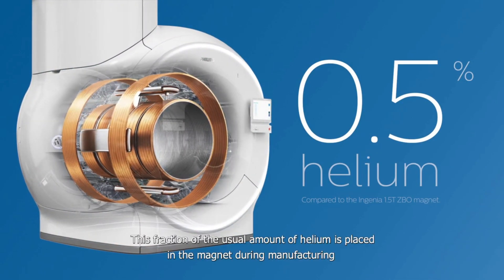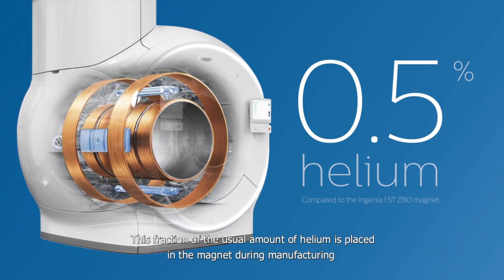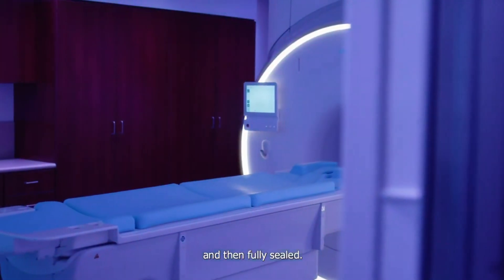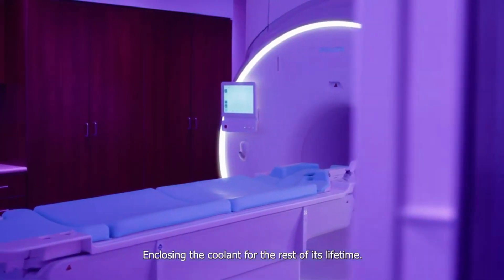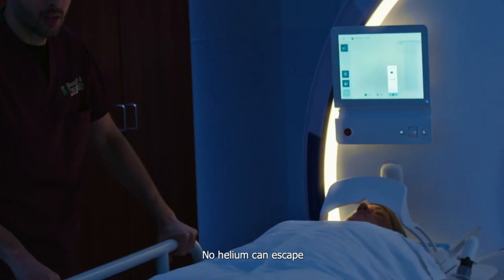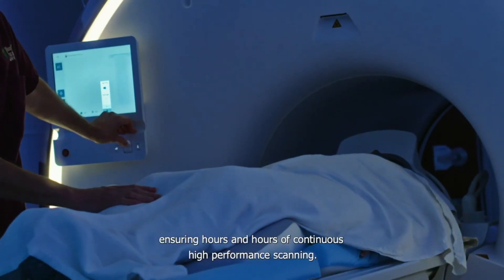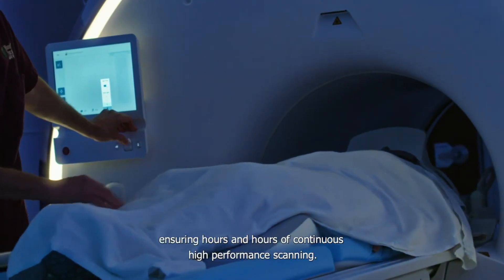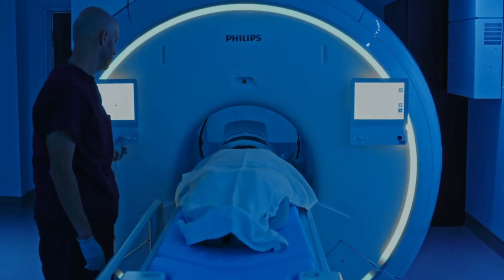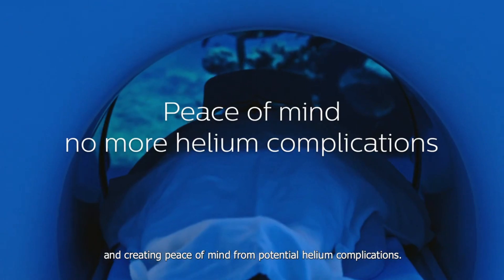In response, UK-based MR Solutions has led the way in developing helium-free, commercial, high-field superconducting magnet MRI systems in preclinical systems. The only way to keep MRI magnets currently in clinical use that cold is by using thousands of liters of liquid helium mined from below the Earth's crust.